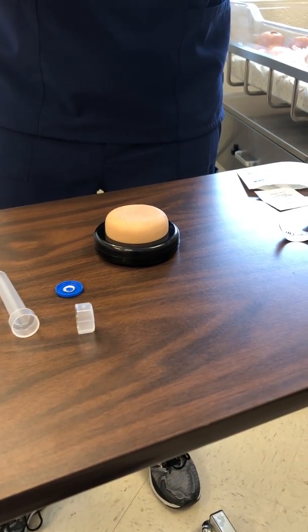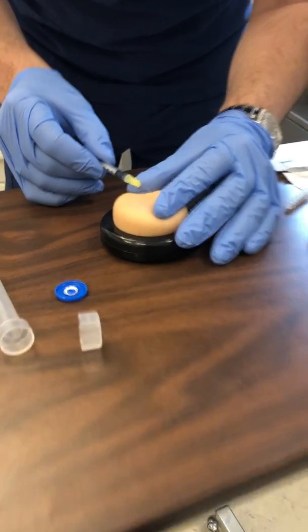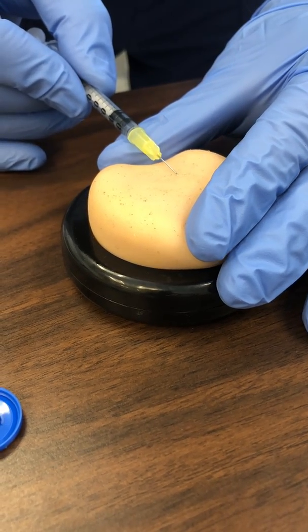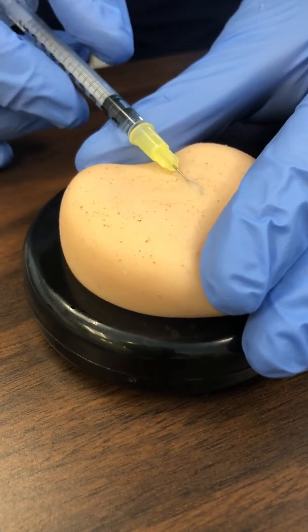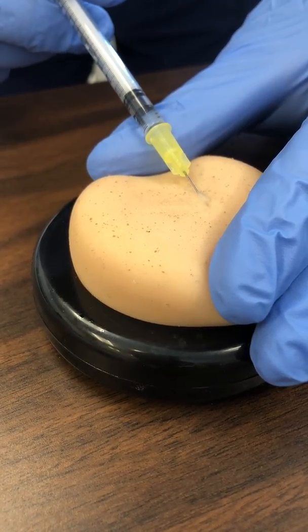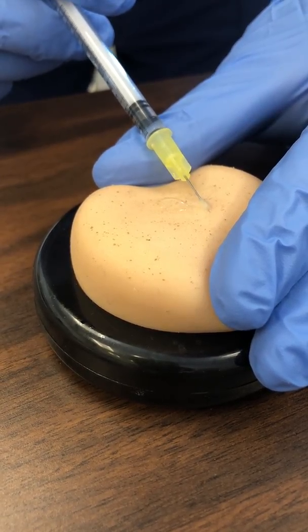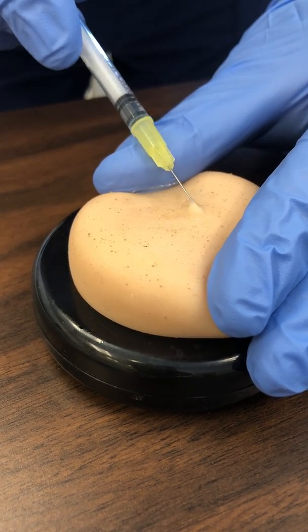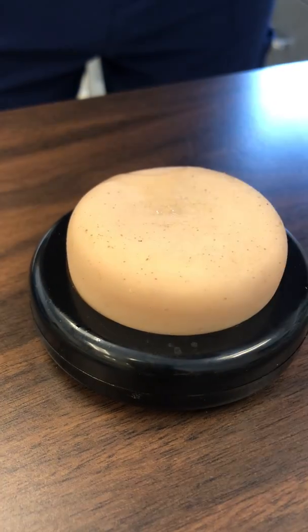We're then going to uncap our needle. I'm going to pull on his skin slightly, and at a 5 to 15 degree angle with the bevel up, I'm going to insert just underneath the skin to where you can still see, and I am going to slowly inject. And I will pull out, and normally you would see a bleb right here of where the injection is.